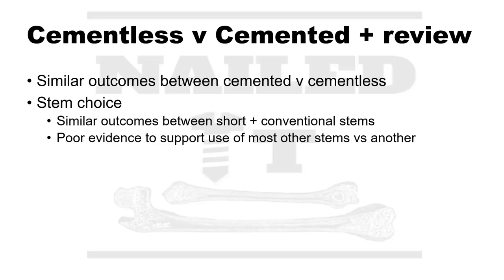Well, Dr. Cohen Rosenblum, I think this has been a great talk. We talked about the different types of femoral stems, when to use one versus the other, and for those that are listening, we're going to transition to some x-rays that we'll try to describe the best that we can and see if we can identify some of the different implants. Dr. Cohen Rosenblum has been so nice as to have a couple of x-rays for us to take a look at. So if you're on the audio and you're at home cooking food, check out their YouTube channel and you can follow along and see some of the different x-rays that we're talking about.